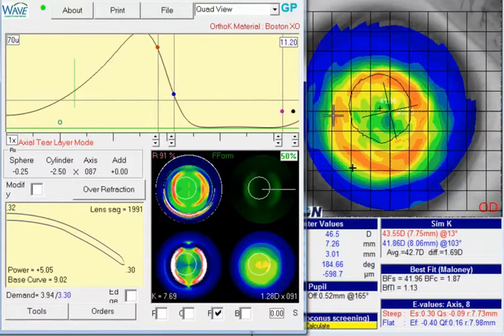The left eye, I would do the same thing. The left eye, it seemed like we had less treatment superiorly and inferiorly, but still it seemed like it was going around more than we expected to. So decreasing demand and applanation of the lens to the cornea vertically while increasing it horizontally should help.